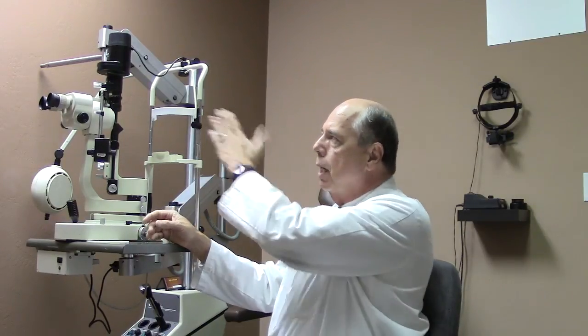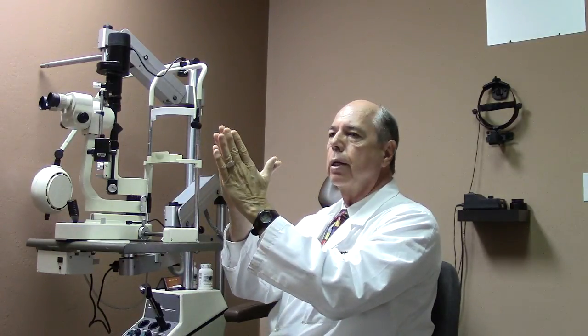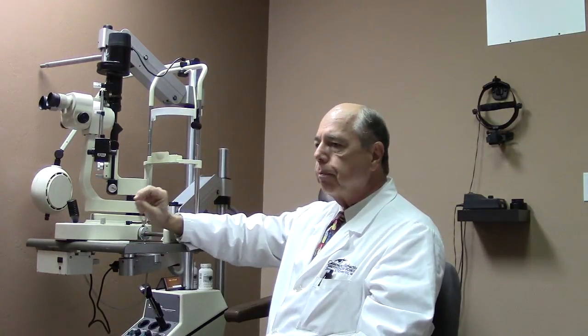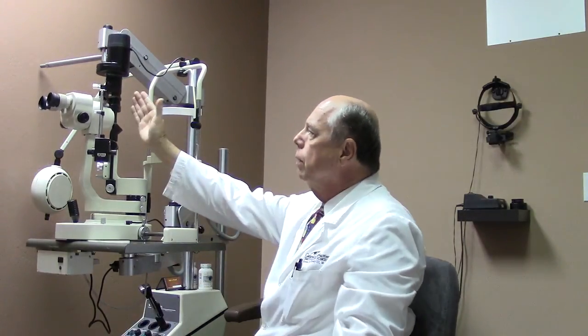The reason it's called a slit lamp is that the beam that comes out of the light — we have the capability of adjusting that to either a round light, like a regular light, or to a slit, which is what we use most of the time. When we bring that slit in at an angle, for the cornea — the clear part of your eye — we can see the different thicknesses and layers of your cornea, and examine those layers to see if they're healthy or not.